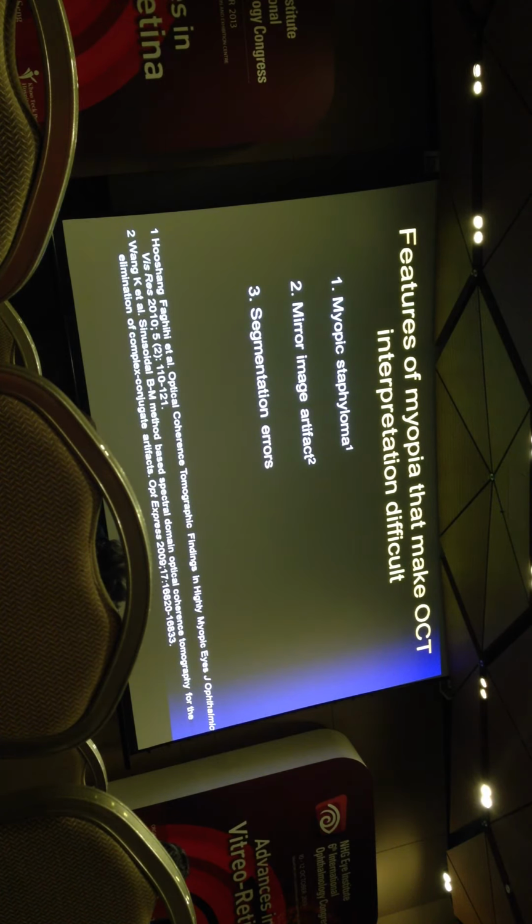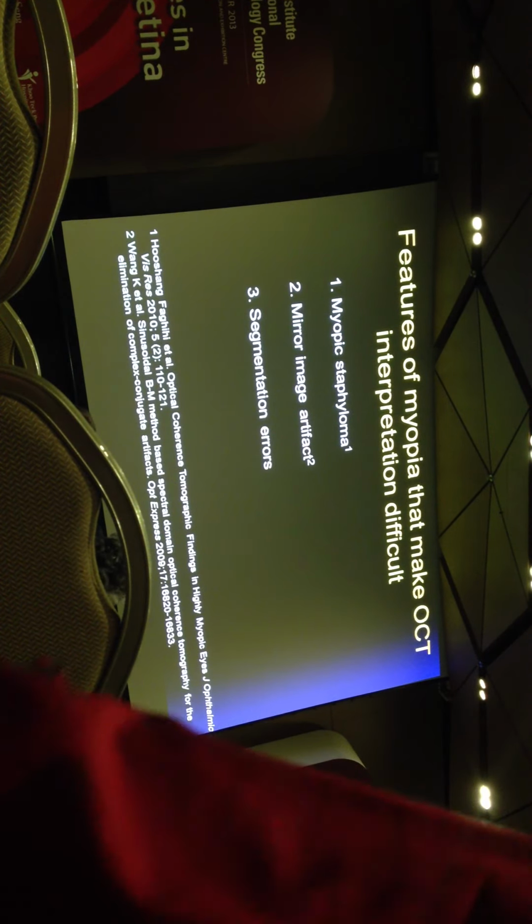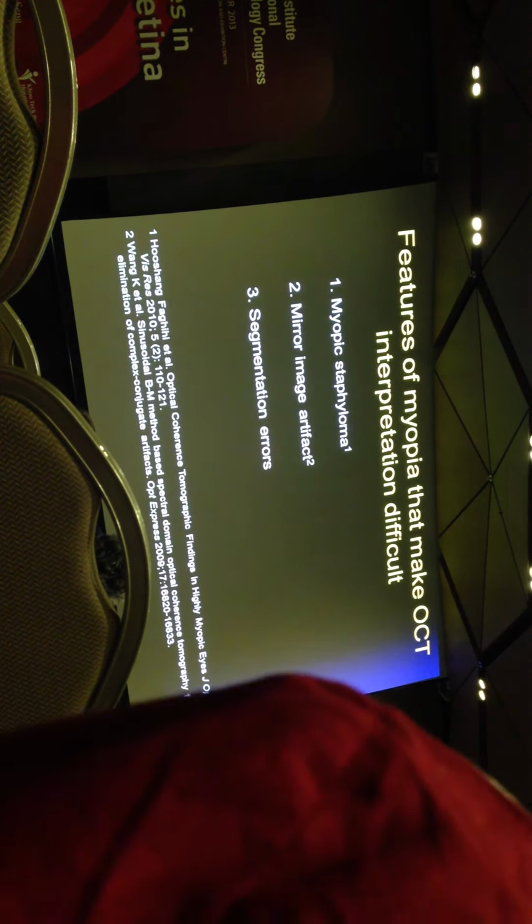eye you're concentrating on. I think also a good tip, which Ethan, if you don't mind, I'd like to share, I heard from Ethan two days ago during the course, is to narrow the scan length if you're just focused on the area of interest, and that will mean the curvature will have less of an impact on the imaging. Did I get it right? Okay.